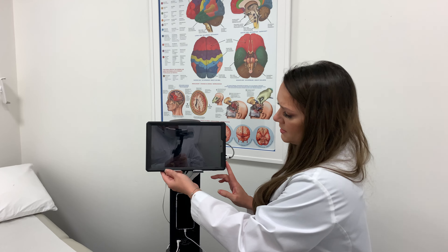In order to do this, you are going to have to contact the provider first. You can either text them or call them, whoever it may be, just to let them know that we have a patient, we have an issue, and we need your assistance.